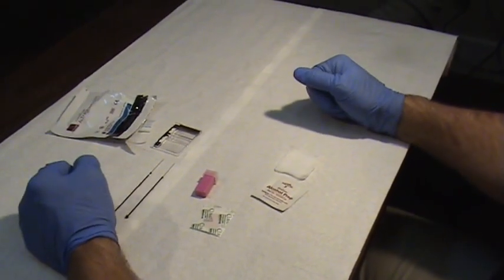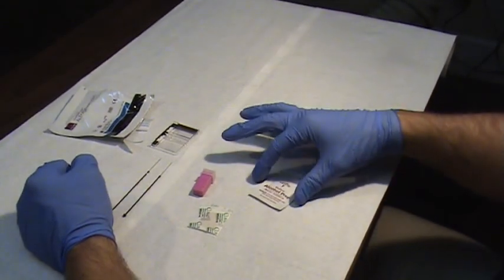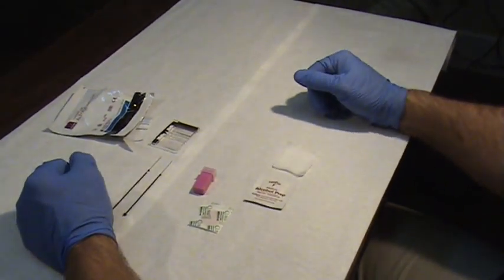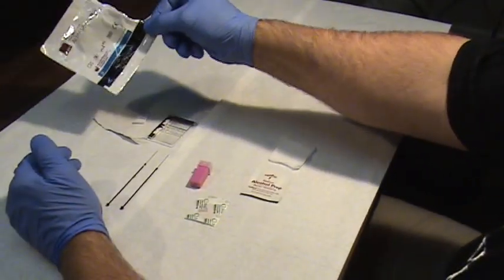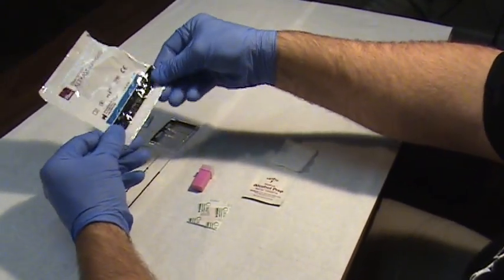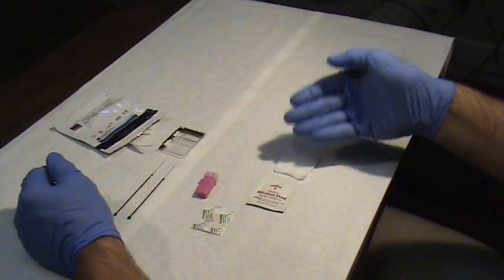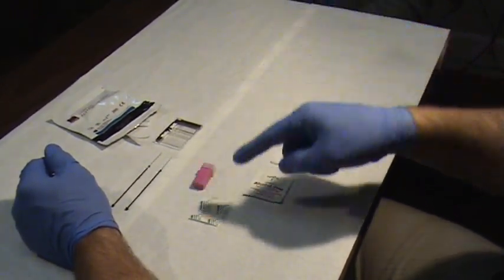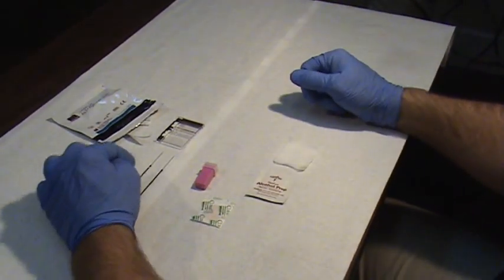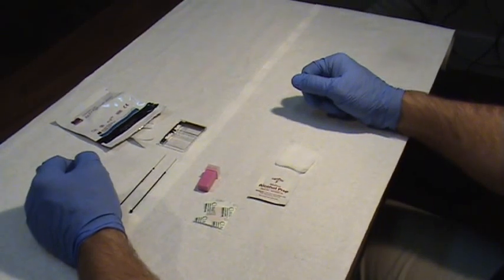When you're ready to do your blood test, you want to make sure that your needed items are all ready. You want to have your test cassette torn open, place your cassette on the table. You want to have your gauze, your alcohol pad, your band-aid, your lancet, and your 2 capillary tubes.